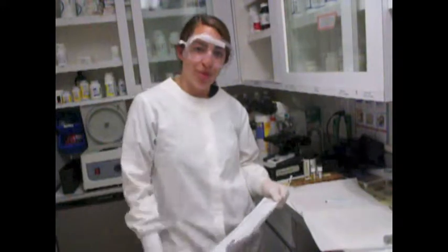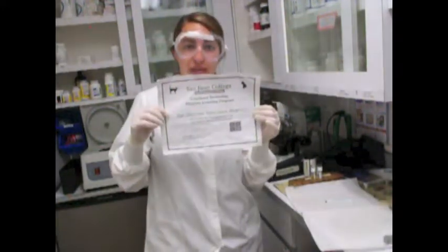My name is Nicole Bruno, and this is task number 20, performing urinalysis. Here is my OCCI certification. So first I'm going to collect my free catch UA sample from my patient.